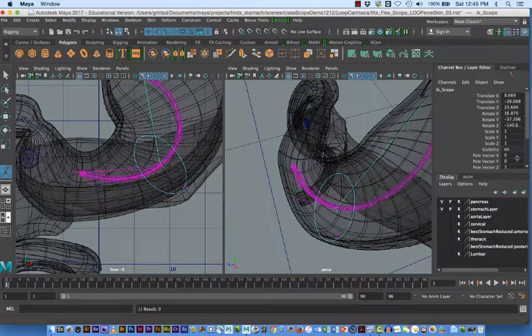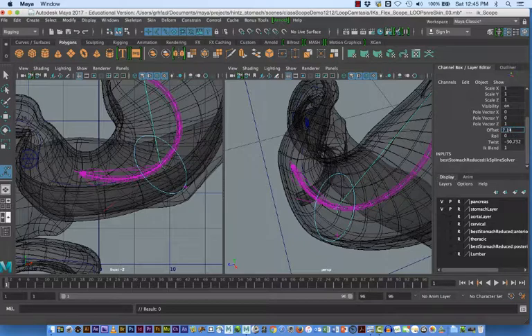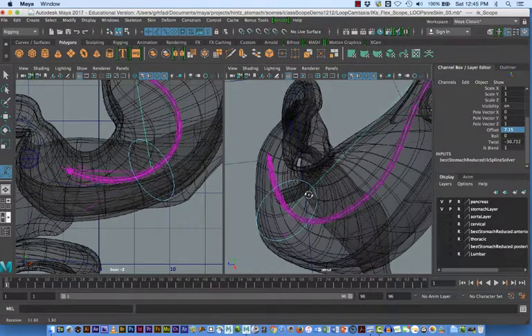I just don't envision it having a lot of rigidity and control. So it would seem that if we just get a little closer, we can get that where we want it. And again, I can see around the corner here, so to speak. So if I need to bend a little bit from the perspective window, I can.